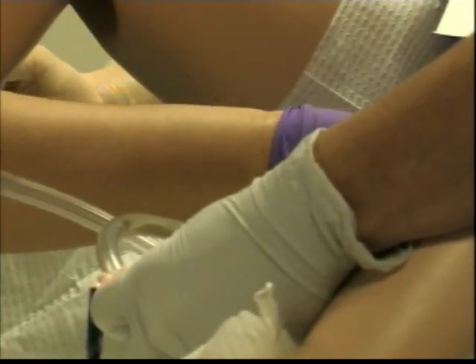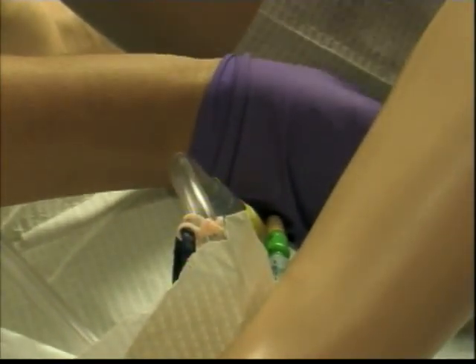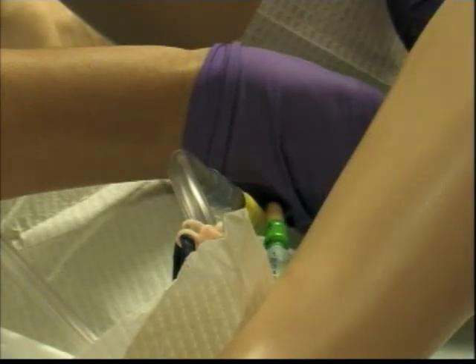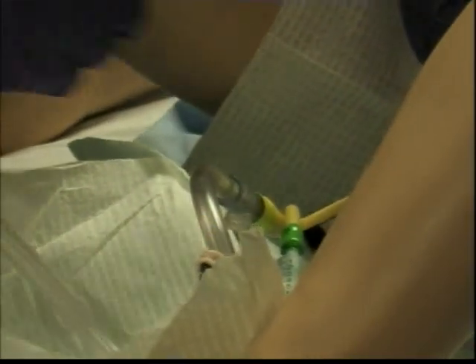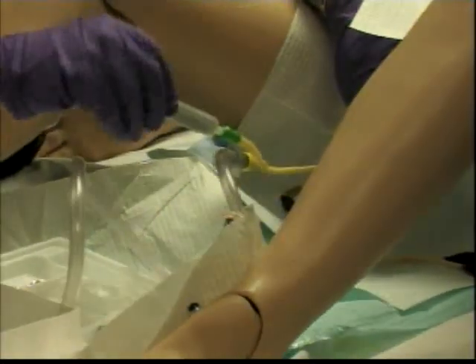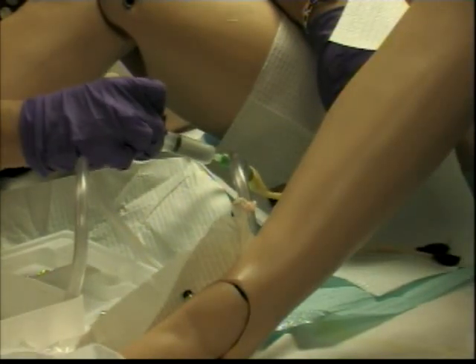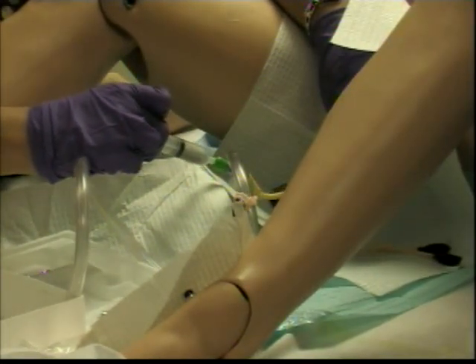Once you have urine return, introduce the catheter one to two inches more. In order to inflate the balloon, you cannot let go of the catheter at all. The hand that was holding the labia — use it a couple of inches away to hold the catheter. Then with your dominant hand, go ahead and inflate your balloon. If you don't do that, the catheter is going to slip out.